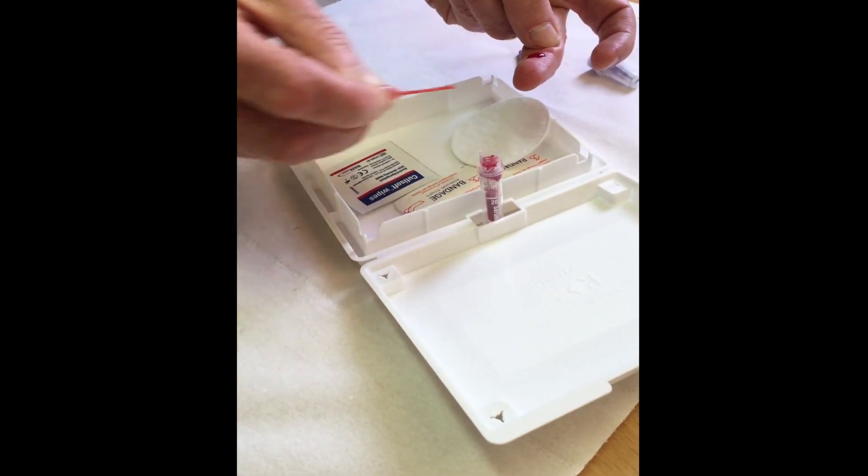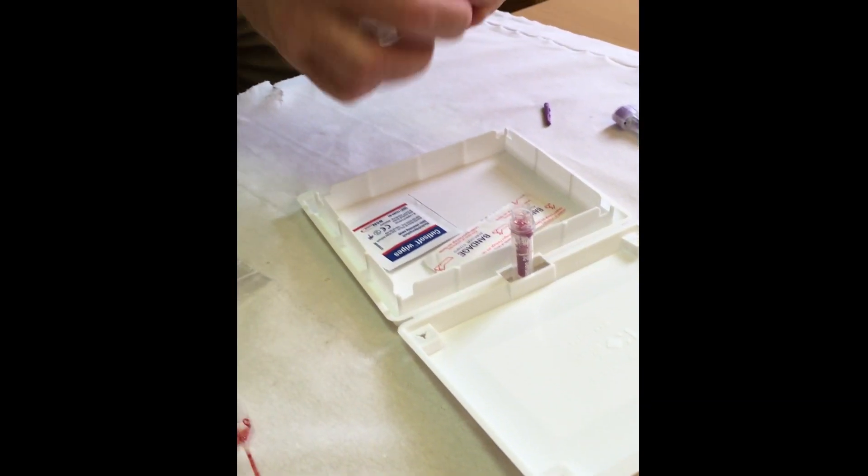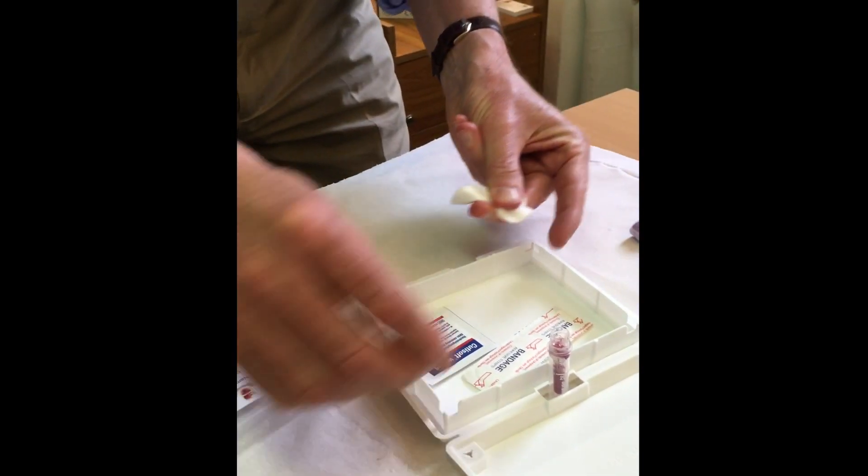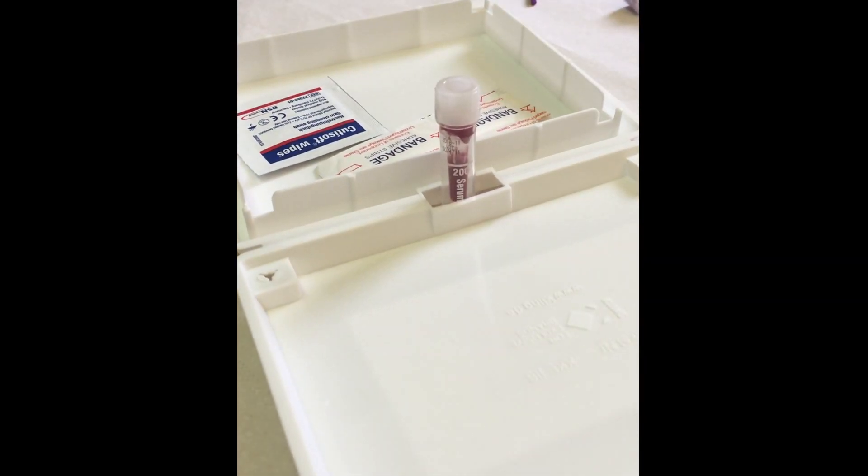That is sufficient. Take the cotton bud and apply pressure to the finger, then to close, click straight down — your sample is collected.